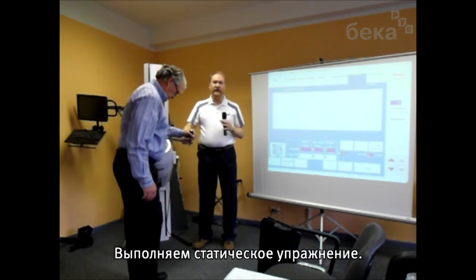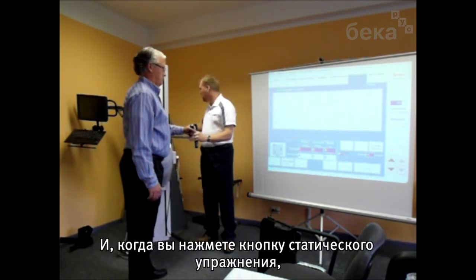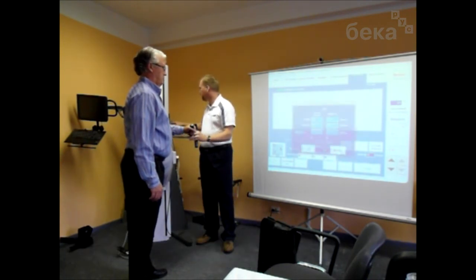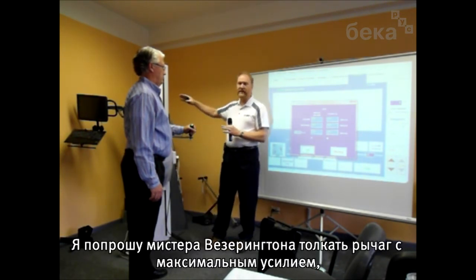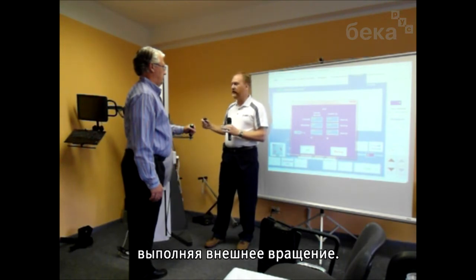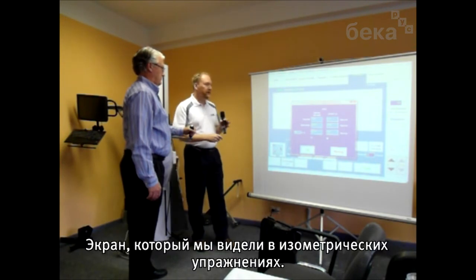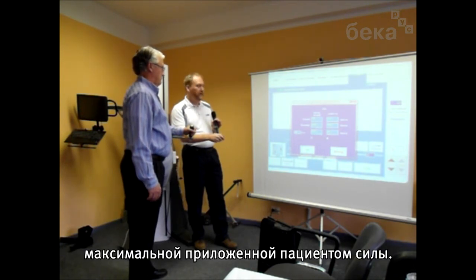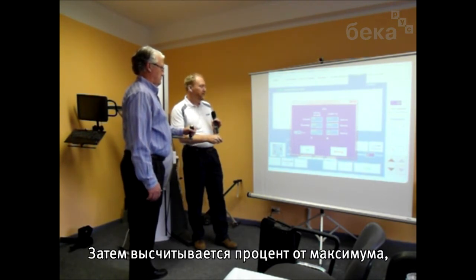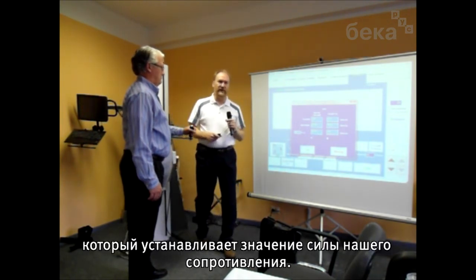So to do the static trial, I'll put the person about midway through range, and then when you hit the static trial button, it locks in that position, and then I'll just ask Mr. Weatherington now to push out against the handle as hard as he can into external rotation. So go ahead and push out, push, push. Okay, and relax. So similar to the screen that we saw in isometric, it's taking a measurement of how much force you can exert maximally, and then it calculates the percentage of that to use as the daily treatment setting for resistance.